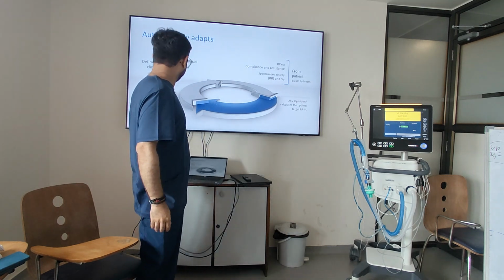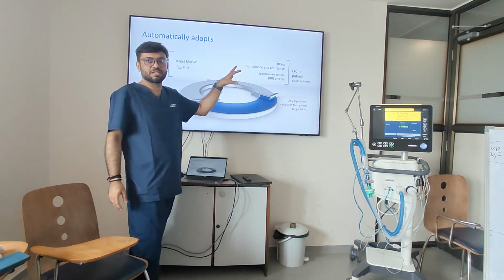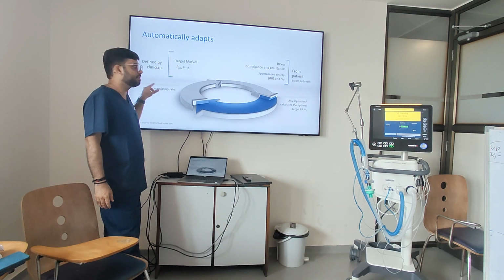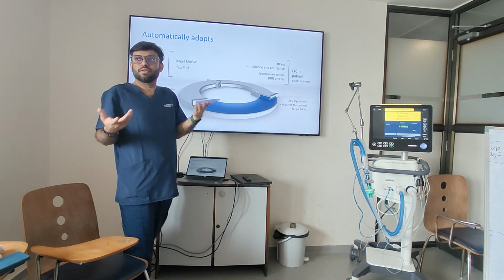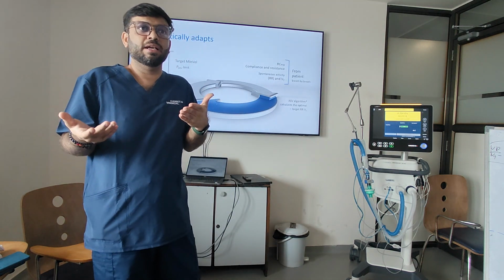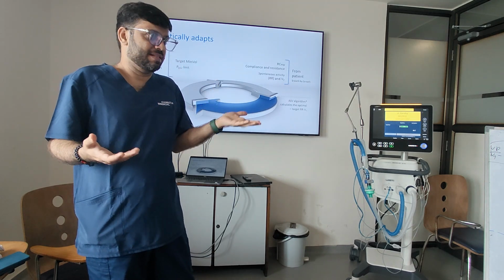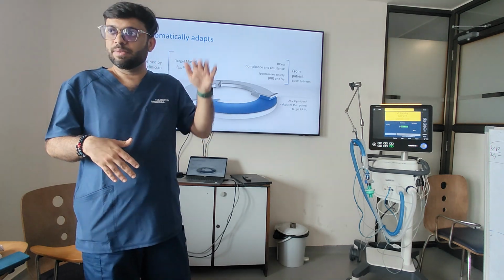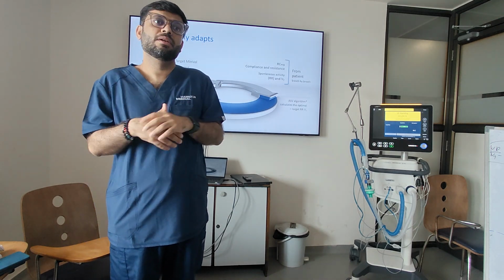You understand? And then as and when the patient's compliance and resistance change, as in time constant, it will regulate the inspiratory pressures and adjust the mandatory rate as per the patient's comfort. So you don't have to really worry, because it's going to auto. Since it's adjusting the inspiratory pressure, it's working more like a pressure regulated volume control when the patient is passive, sedated. It will decrease the pressure and try to give the best possible volume as per that patient's lung mechanics.